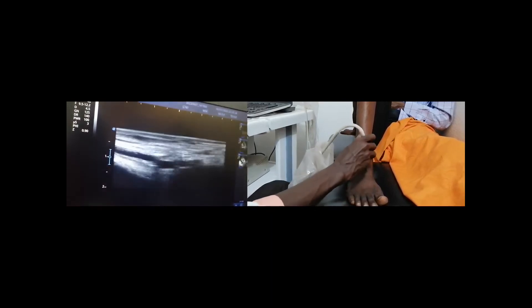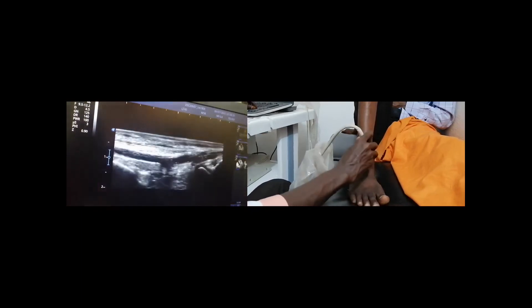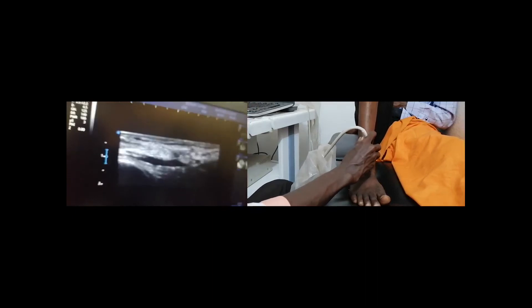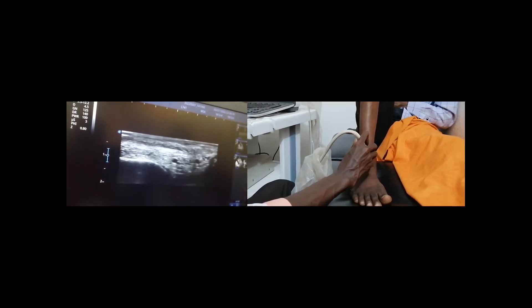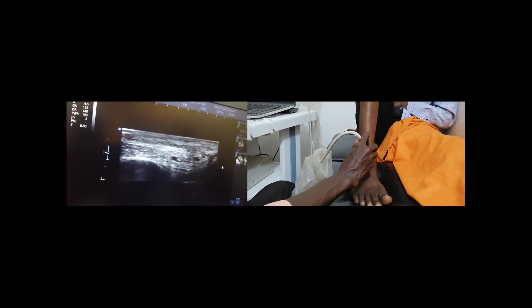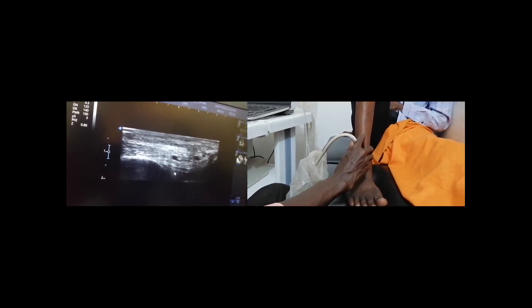The anterior compartment recesses include the tibiotalar joint with an anterior fat pad. Here is the tibiotalar joint including the anterior fat pad and the hyaline cartilage.